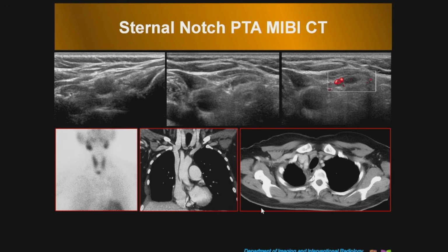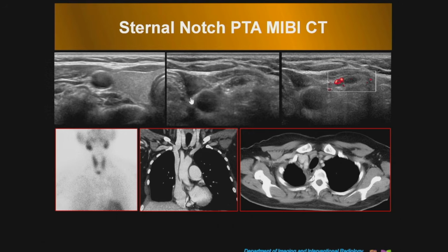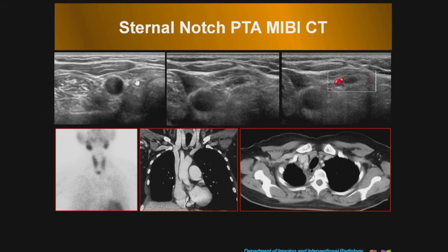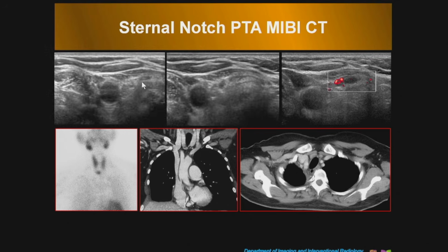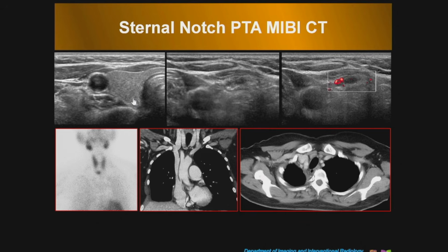This one is down in the neck. I'm going to run this movie clip for you. From the top to the bottom, we'll have a look at this one. I'm going to run both these movie clips for you. This is Doppler, we'll come to it in a minute. So you can see we're starting at the top, coming all the way down into the supraclavicular fossa. And there you see something that should not be present. We'll come back to that in a minute.